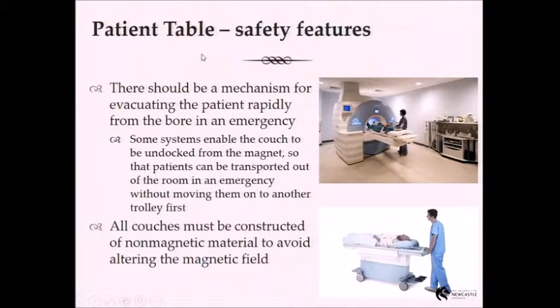Just a few safety features. There always has to be a mechanism where you can rapidly remove the patient in an emergency. I'll give you an example. Say you've got someone up inside the scanner and you inject contrast, and they have a reaction to that contrast and you need to get them out of there in a hurry to treat them for that contrast reaction.